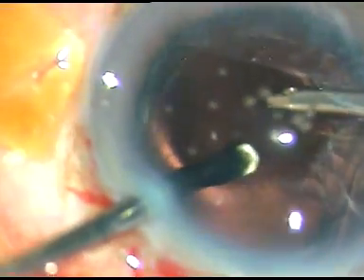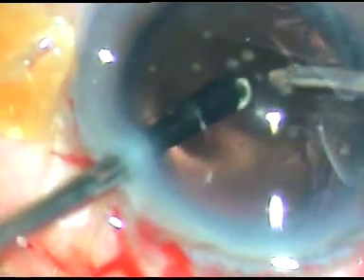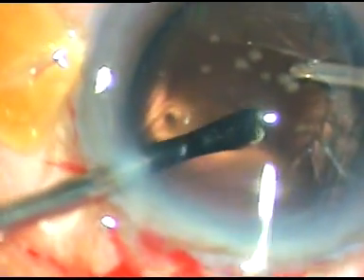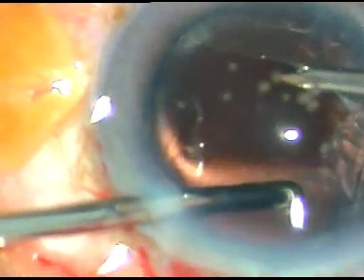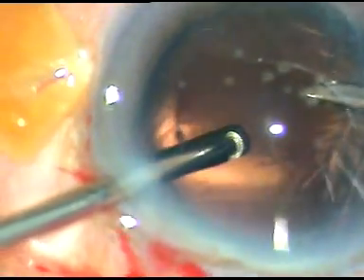It is not recommended by our teachers. We should do pars plana anterior vitrectomy. I could have done that, but didn't do.